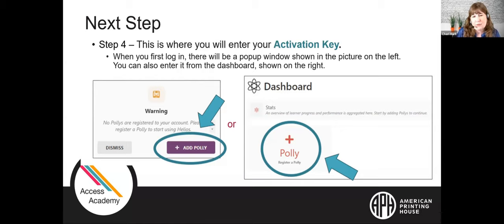Here we have Payson starting on the alphabetic word sign lesson. Alphabetic word signs are special letters that represent an entire word — for example, 'but' is an alphabetic word sign represented by the letter B. This gives you a little example of what the Polly sounds like during a lesson.